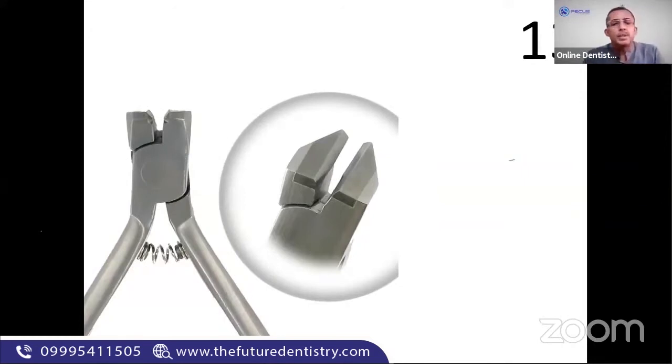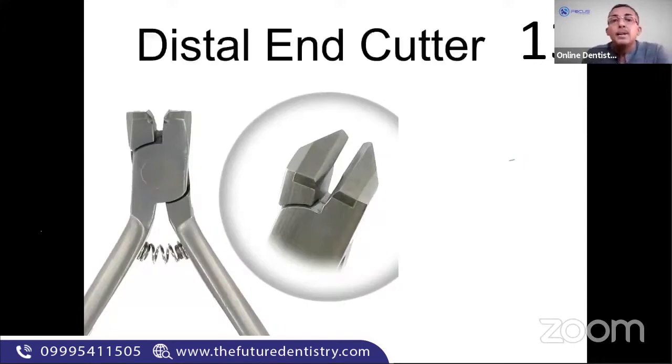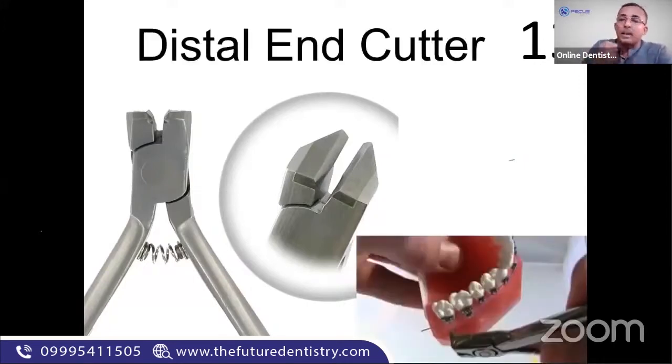If everybody knows this, guys, I'm stopping this here. Distal end cutter, Deep Ranjan. Distal end cutter. Bracket placer. No, it's a distal end cutter. Dr. Deep Ranjan has said that correctly. This is a distal end cutter to cut the distal end of the wire. You can go all the way back inside and cut it. So that's a distal end cutter. It has a 90-degree angulation so that you can nicely go inside and cut it as a distal end cutter.